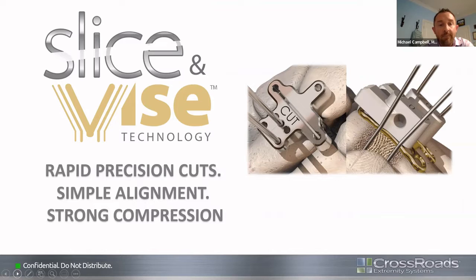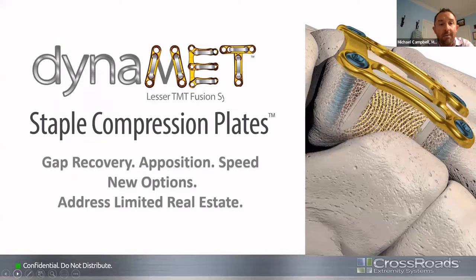And the plate, the rack block, the compression block that you see there on the right side picture, is what squeezes those wires together, creates plantar compression, and goes directly over the plate. The neat part about this is placing a plate in a midfoot joint can be fiddly. There's not a lot of real estate on the cuneiform. The wires by default put the plate in the ballpark of where it needs to be, so it becomes a lot easier.